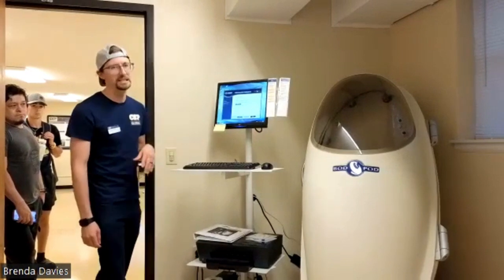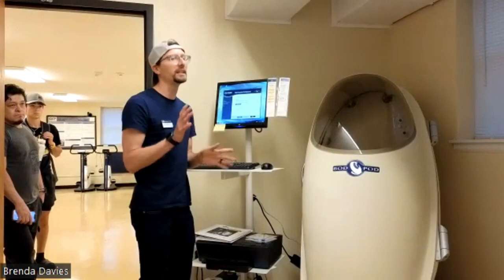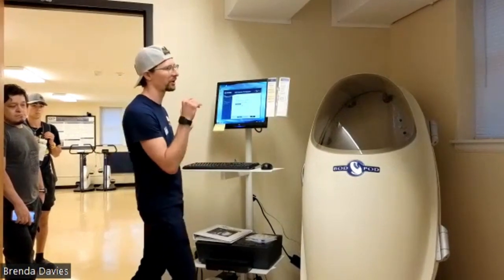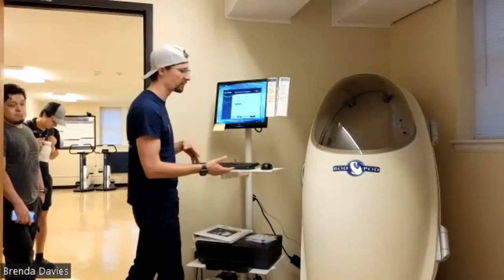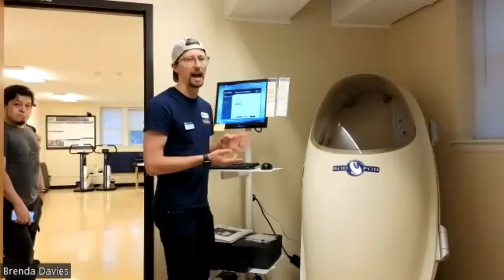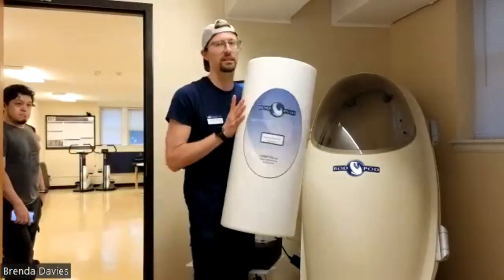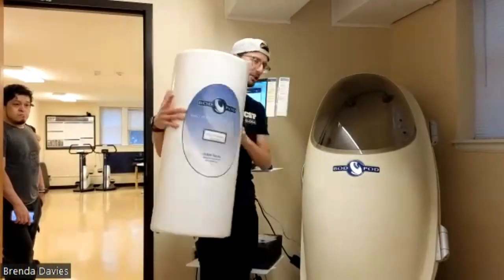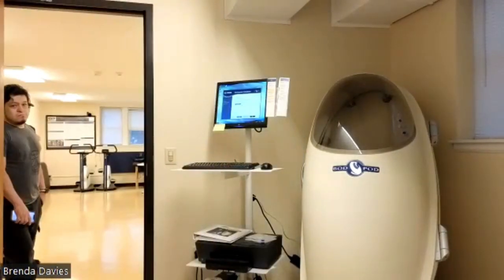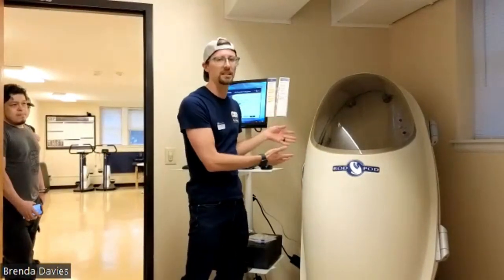The computer actually takes a decent amount of calibration to get this up and running. It takes about 40 minutes to calibrate. There are a number of quality checks that you do. You have to make sure that each of the systems are running and communicating well, and also that what's being measured is actually accurate. To do that, you take this calibration cylinder, a known volume, and put it inside the Bod Pod. With this, we're trying to determine if the volume of the person that we put into this, the unknown volume, can be assessed appropriately.